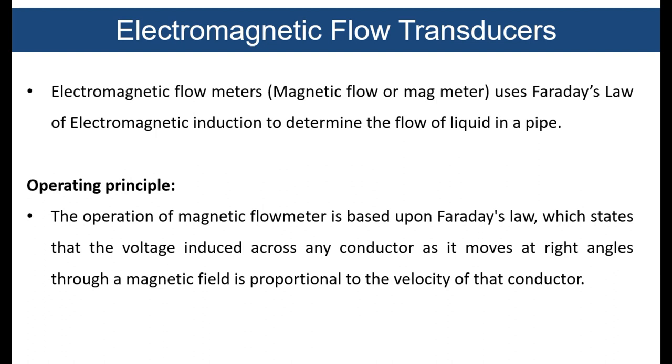Like I already said about blood flow meters, we have the electromagnetic flow meters over there. This electromagnetic flow transducer is utilized in electromagnetic blood flow meters. These are also known as magnetic flow meters or magmeters, which use Faraday's law of electromagnetic induction to determine the flow of the liquid in the pipe.